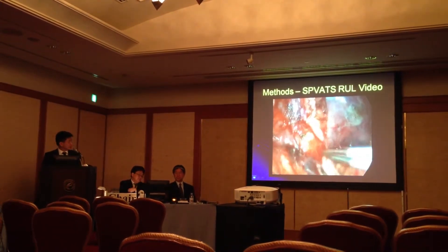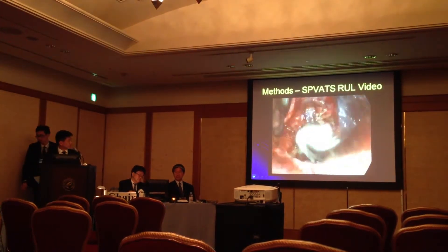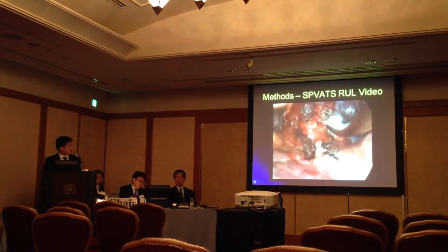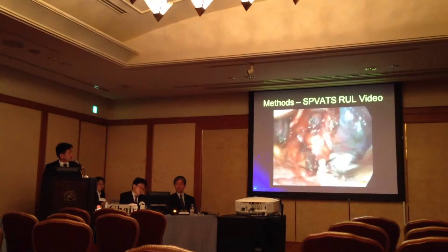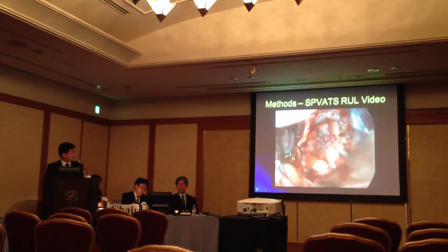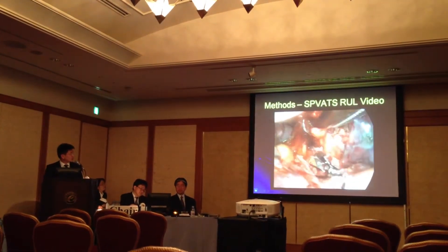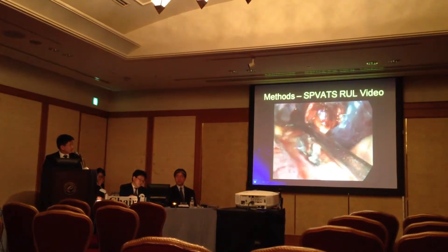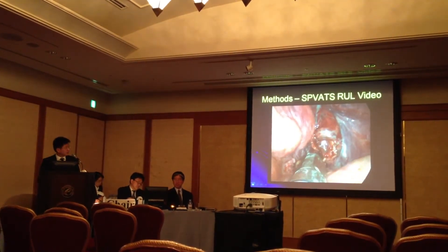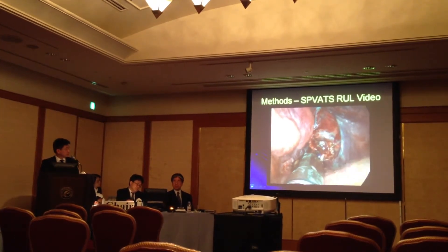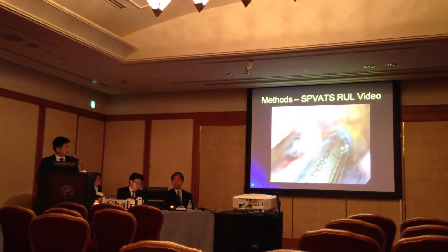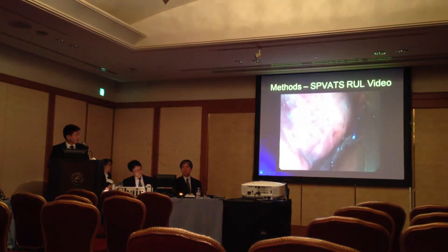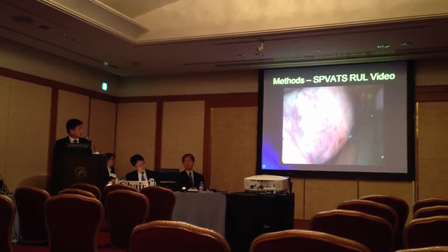That helps with stabilizing the image and the vessel during dissection. Finally, we go for the upper lobe bronchus, which runs around the top of the hilum. We can see the bronchus nicely with its rings — the upper lobe bronchus. We remove all soft tissue superior and inferior around it, sling the upper lobe bronchus, and as you can see it is coming out nicely. We can crush it with a sponge holder before applying the stapler to complete the bronchus. We do an air test before firing the stapler to confirm we have the correct airway. For this case, it is just the posterior fissure to complete with three or four firings of the stapler.